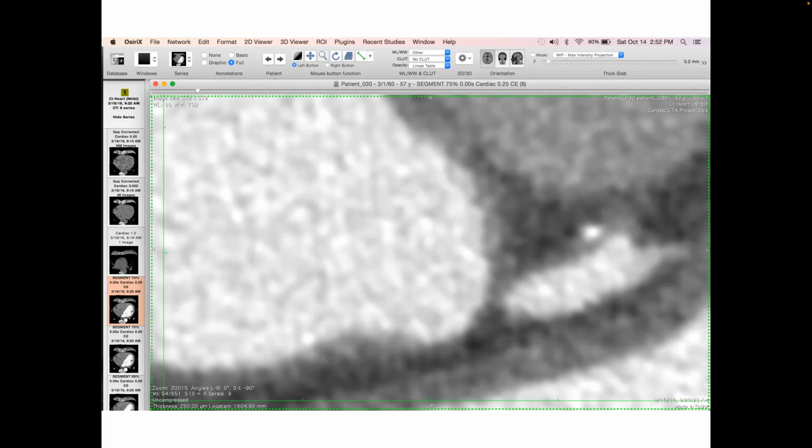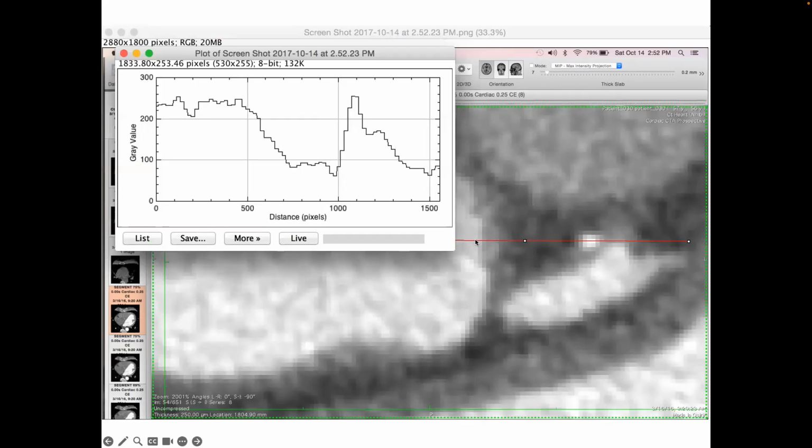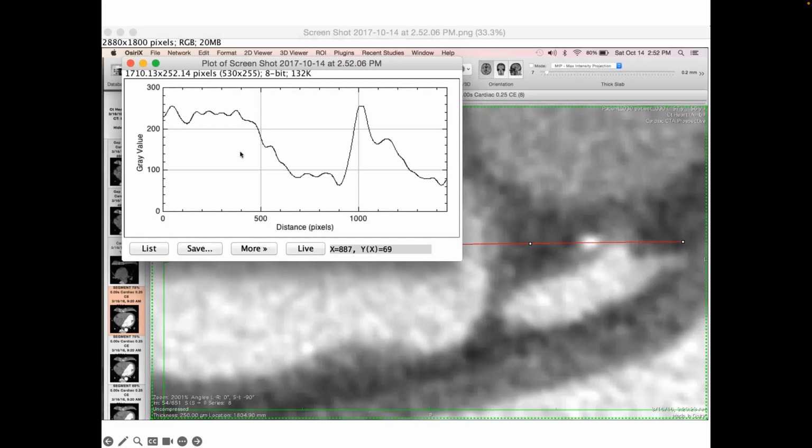Again, it's a very quick and dirty way of telling someone what the resolution of your picture is. It's just the space between the voxels. If you go back to before we did that interpolation and you look at the curve through an object like this thing here, you can see these very discrete steps. So we have a very discrete looking image. When we do the interpolation, that's probably a more realistic version of what's in there. This is what's in there convolved with the point spread function of the system, right? So it's going to be blurred by the system, can't get around that. But at least we see the underlying truth just blurred with the point spread function of the system.